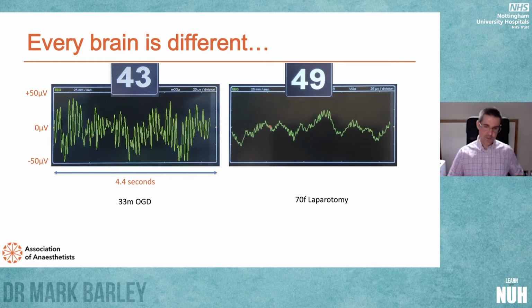So I wondered to myself, why do some old people look a bit flatter? Some other old people might have very much younger looking EEGs. I noticed that these young looking EEGs with these nice big tall waves seem to wake up really nicely. And some people with flatter looking EEG waveforms seem to take a bit longer to wake up and perhaps not be so sparkling. So I thought I'd tell you a bit about what I've found out.